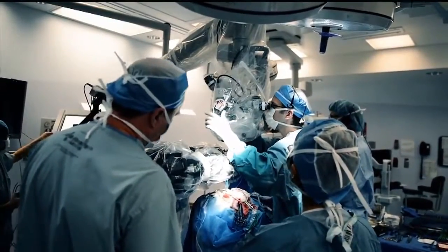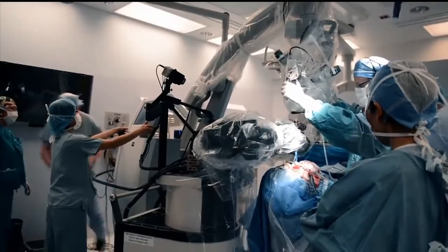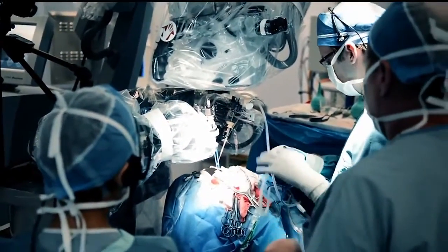So the theme of this project is that the person would be getting images, but then the robotic arms would enter the image and remove the problem while you're taking pictures of it. That's the fundamental goal of the project. What does the robot look like? He looks like a surgeon without a head.